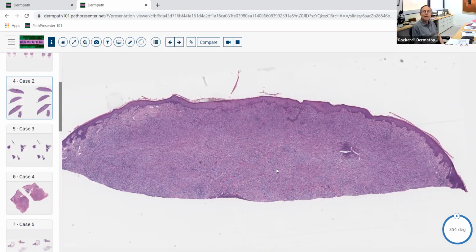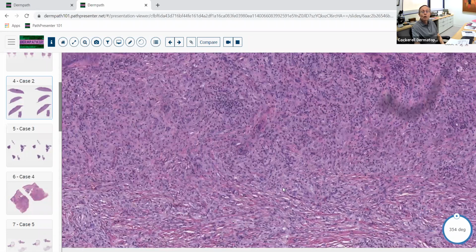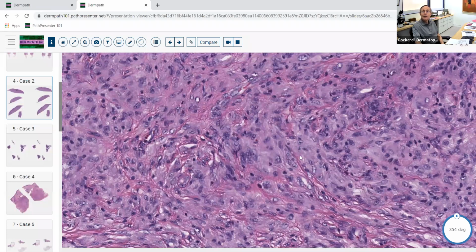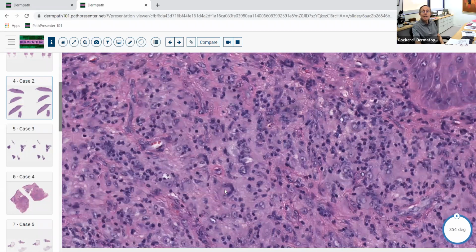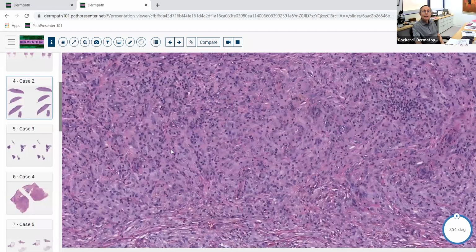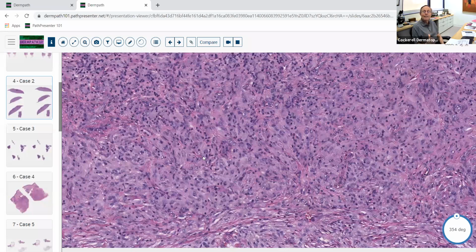So here we have lots of histiocytes, but we also get large multinucleated histiocyte-like cells in this lesion. And this is a xanthogranuloma. So we're talking about xanthogranulomatous inflammation. Xantho means lipid, so you'll see lipid-laden histiocytes, plus possibly epithelioid histiocytes. And if you scroll around, you'll start seeing some Touton giant cells, cells that have multiple nuclei in them. And they'll often have two tones of cytoplasm. You get the cytoplasm that's got some lipid in it, like here, and then you get that kind of amphophilic cytoplasm in the periphery. So this isn't typical granulomatous inflammation, but it is a process associated with histiocytes. So it's quote granulomatous, if you will, and it's what we call xanthogranulomatous inflammation.